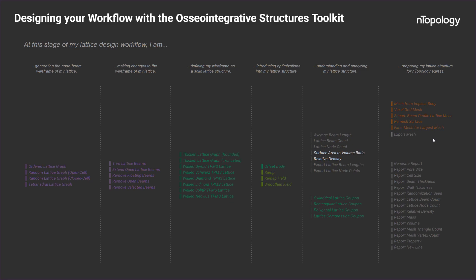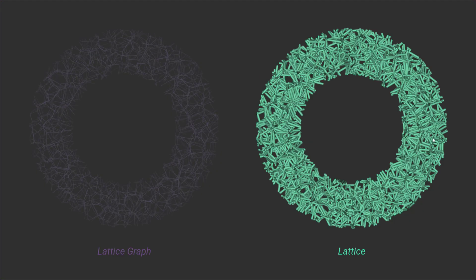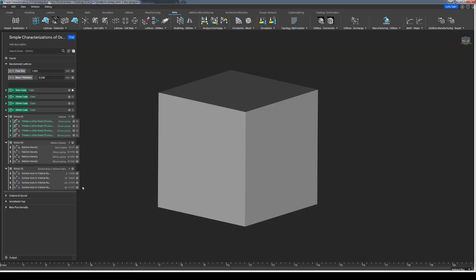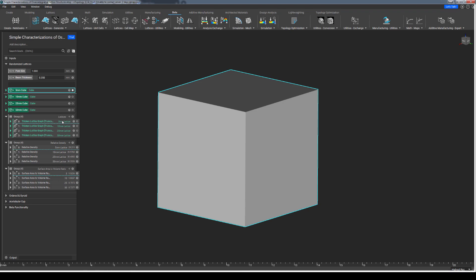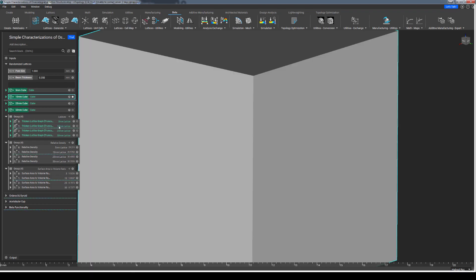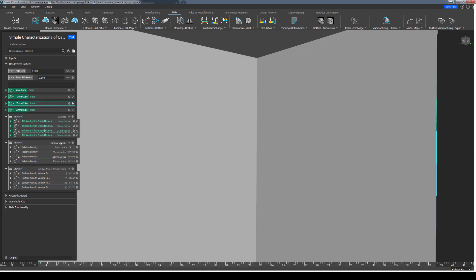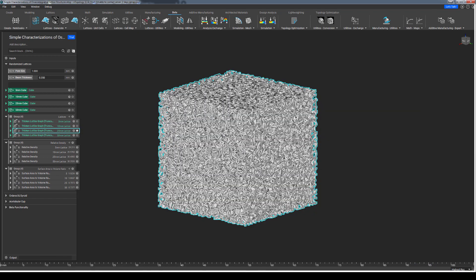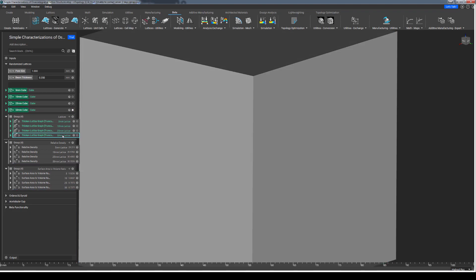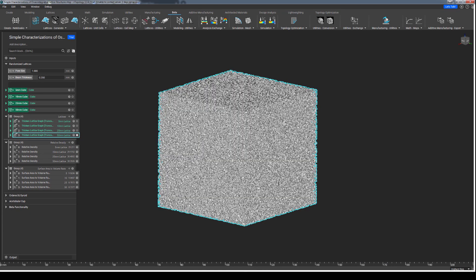Today's focus is on the lattice structure analysis aspect of this osseo-integrative structures toolkit, and to be specific, the blocks we are looking at will impact lattices after they have been thickened. In this file, I have a few cubes of different sizes already created, and for each of these cubes I have a randomized lattice structure generated within each of these cubic volumes: 5×5, 10×10, 25×25, and 50×50. Each of these lattices only differ in the volume in which they fill, but they share the exact same input parameters of beam thickness and target pore size.